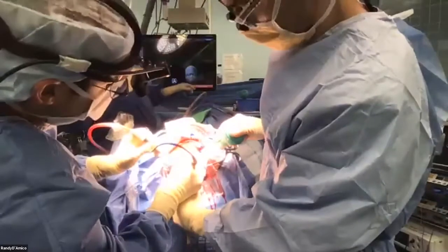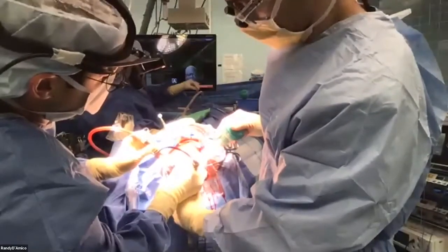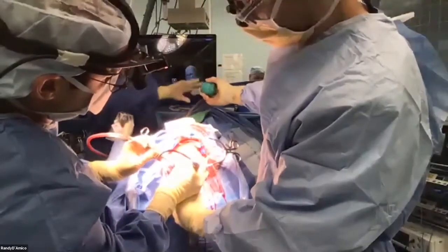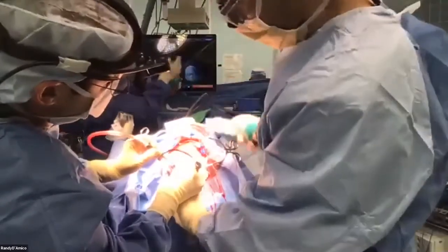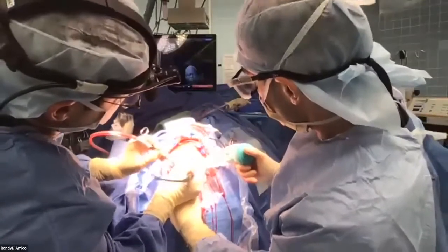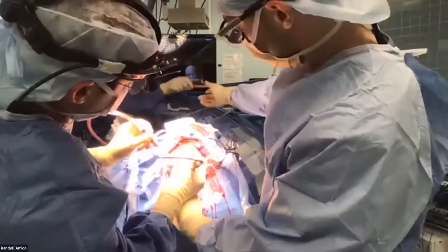So what I want you to do is now get your depth out here, right? You're over tumor, you're over normal brain, and you can find dura down over here. That's going to be thick because you're right over motor strip, right? Some more irrigation, please. Little wax on a stick. Take that. Or here, finger wax. You got finger wax? Perfect.